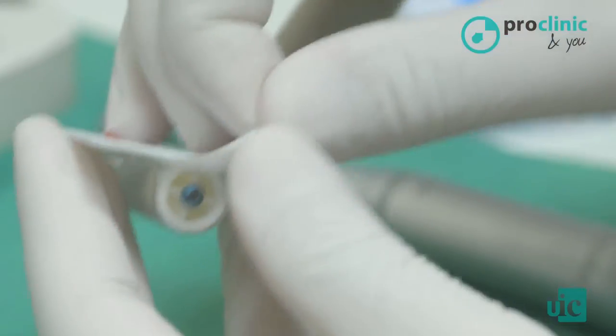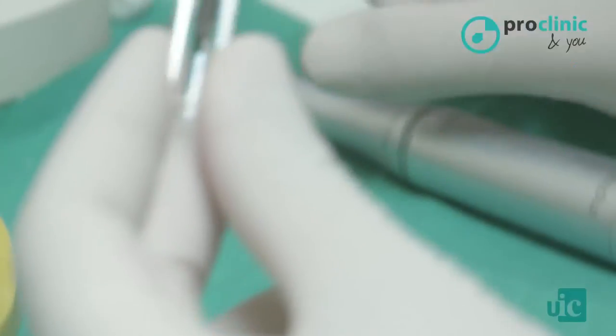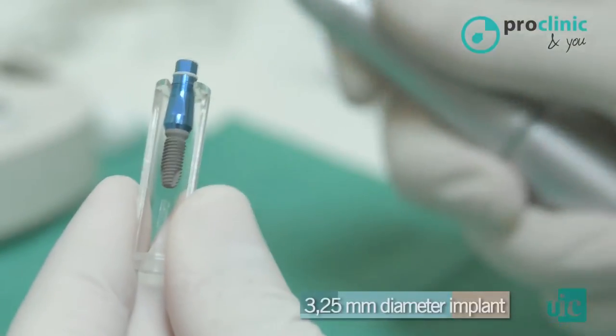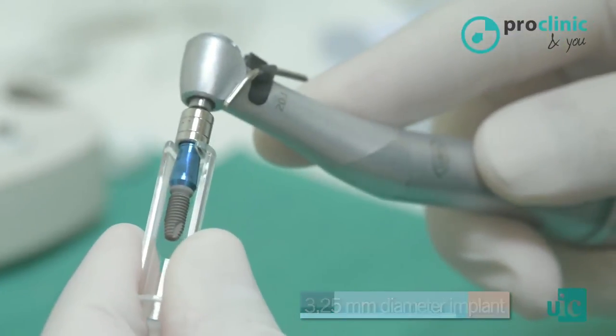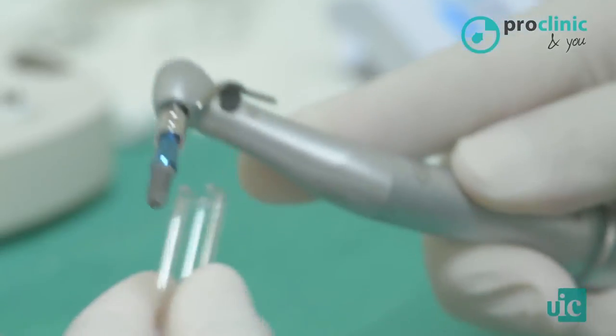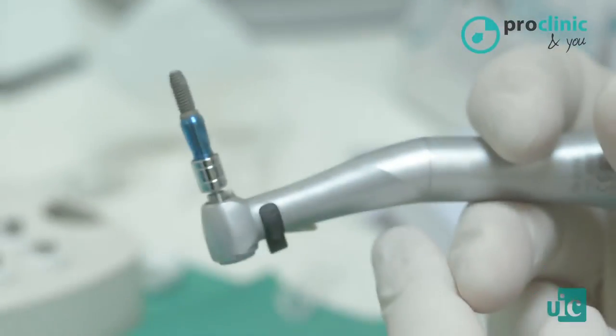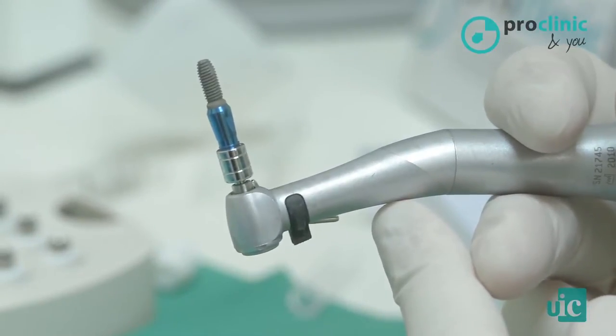We proceed with the implant unpacking. Remember that in a real case, this step must be done by your assistant. Here, you can see the implant and its transporter, and now we are going to collect it with the contra angle. We pull down the blister, and once the implant is picked up with the contra angle, we proceed with its implantation.